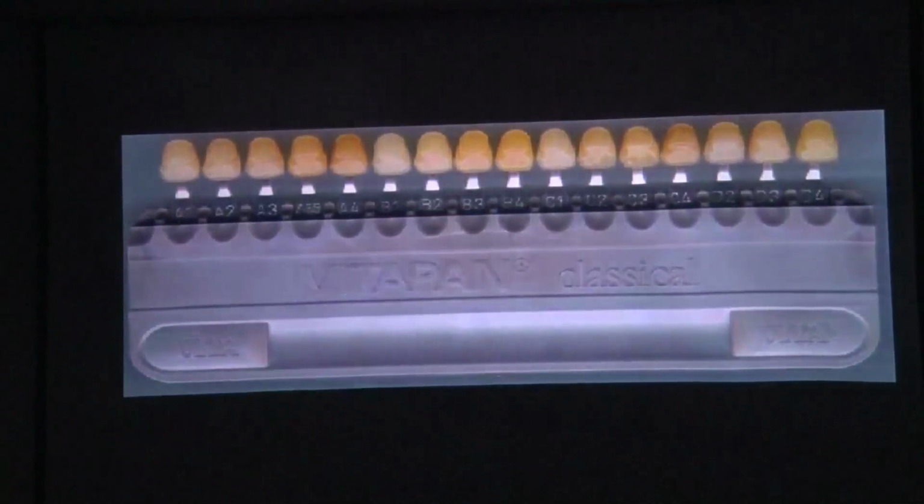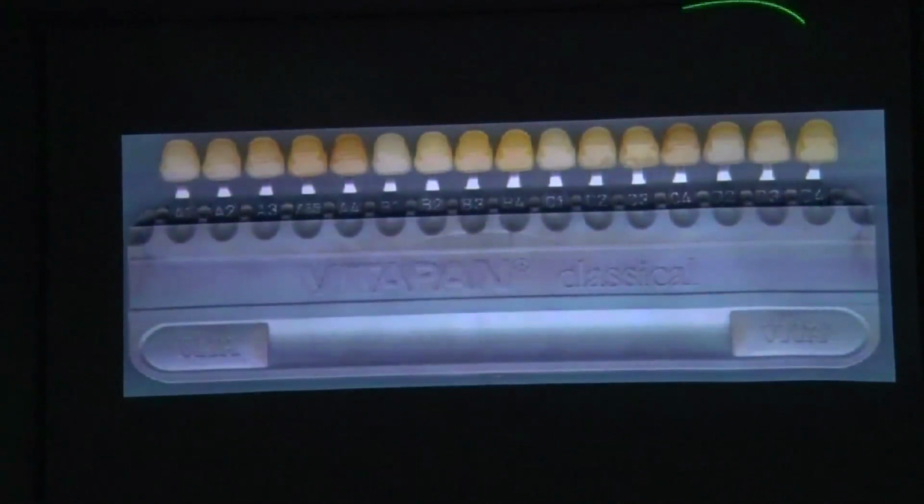And I'm sure all of us use Vitapan Classic, which is more for ceramic, not for composite. It starts with A1, ends with D4. It's a hue-based shade guide. Please remember, Vitapan Classic is based on hue. And if you want to know the value, you need to buy a Vitapan value-based shade guide. And the value-based shade guide starts with B1, because B1 is the brightest.